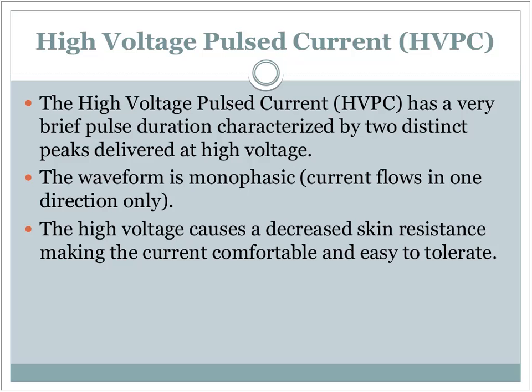Sometimes that won't matter if you're just looking to get muscle contraction. You can just set it up, and it's going to flow from the negative to the positive, and it'll work. You don't have to worry about whether this electrode goes here or there. Where that really comes into play is with wound care.